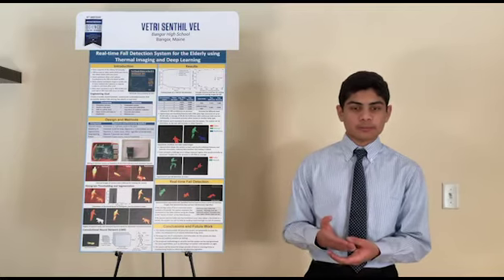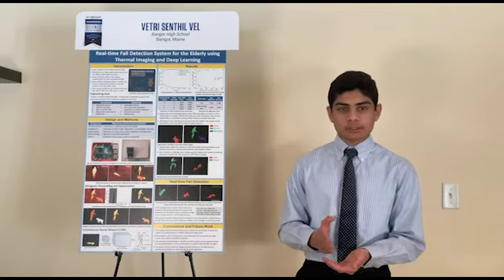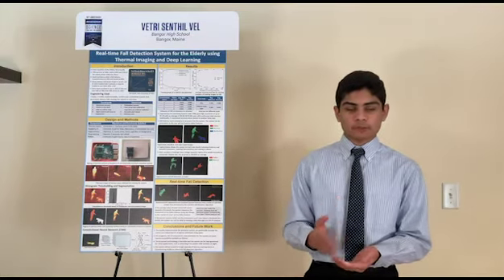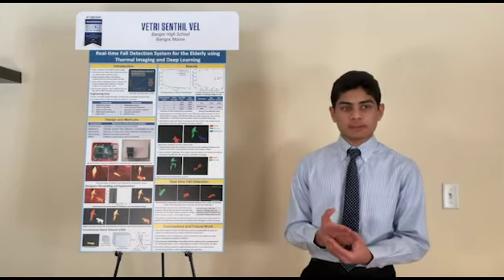In the case of medical alert pendants, older adults often forget or prefer not to wear them, and may be unable to use them if injured after a fall, or if they fall from something like low blood pressure. As an example, my neighbor's elderly mother removed the medical alert pendant before going to church, and then forgot to wear it after returning, then fell and broke her hip and couldn't call for help. Only the next day did people check on her, and she had to be admitted to the hospital.